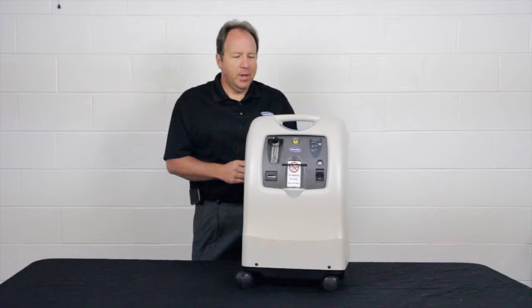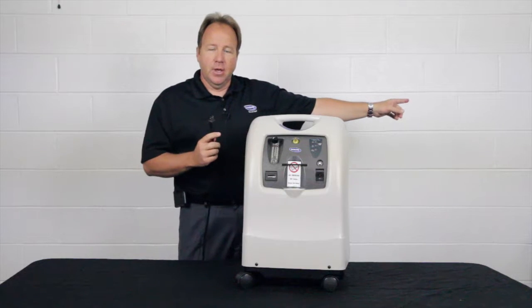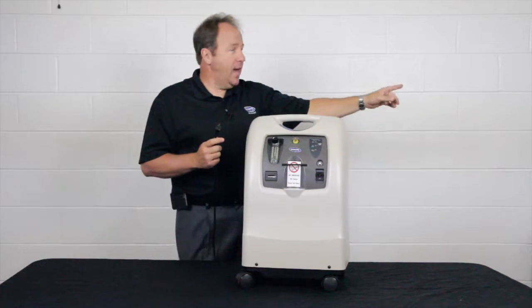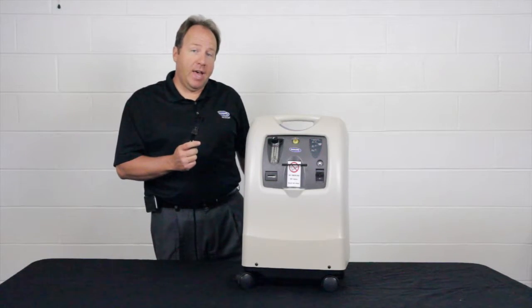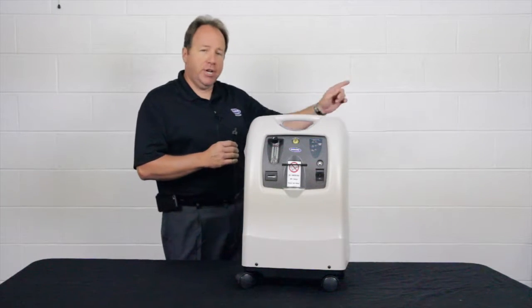Number two, you could have a situation where the wall outlet may have an on-off switch. So maybe over by the light switch, that light switch may run the power to that wall outlet — that could cause a power outage. So you might double check your light switches.